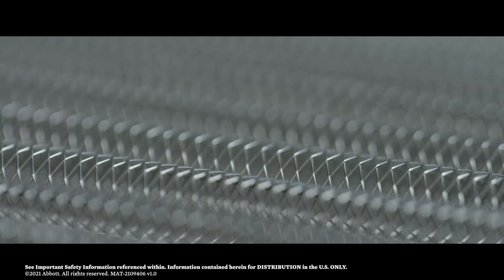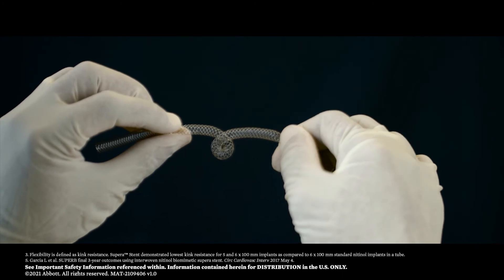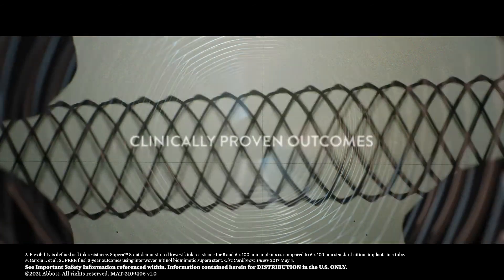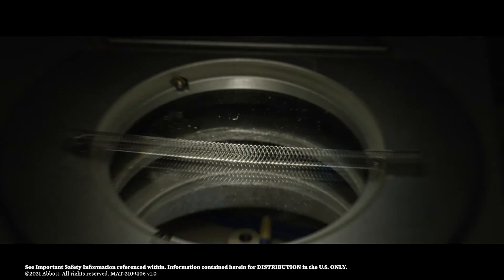As compared to many other standard nitinol stents, Supera interwoven technology delivers high structural integrity, excellent kink resistance, and clinically proven outcomes you can depend on to help you conquer the complex.